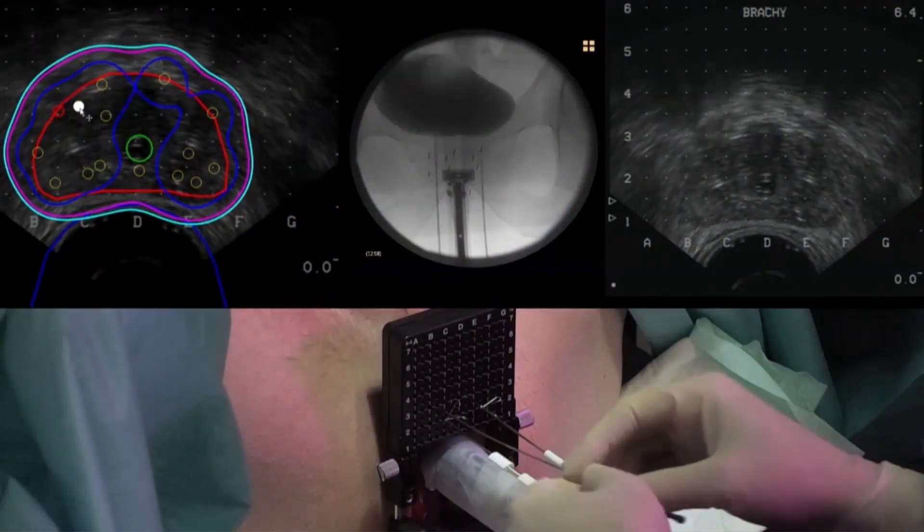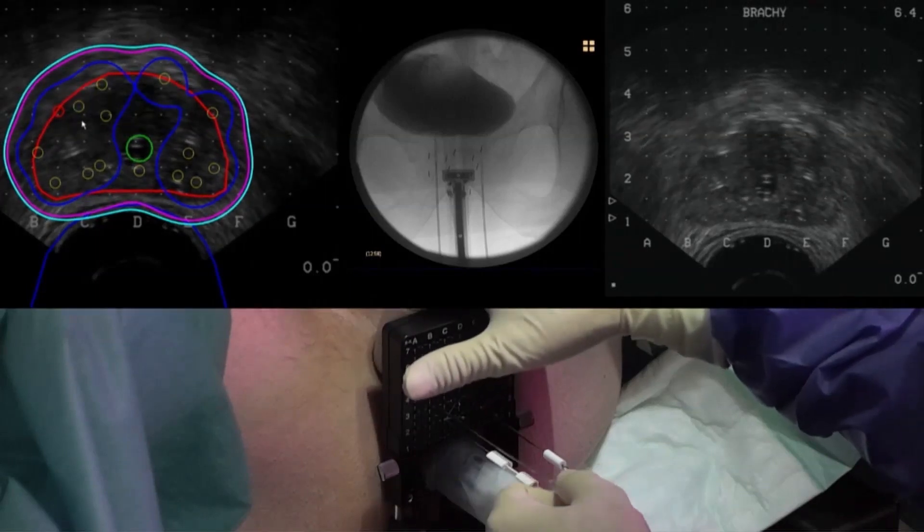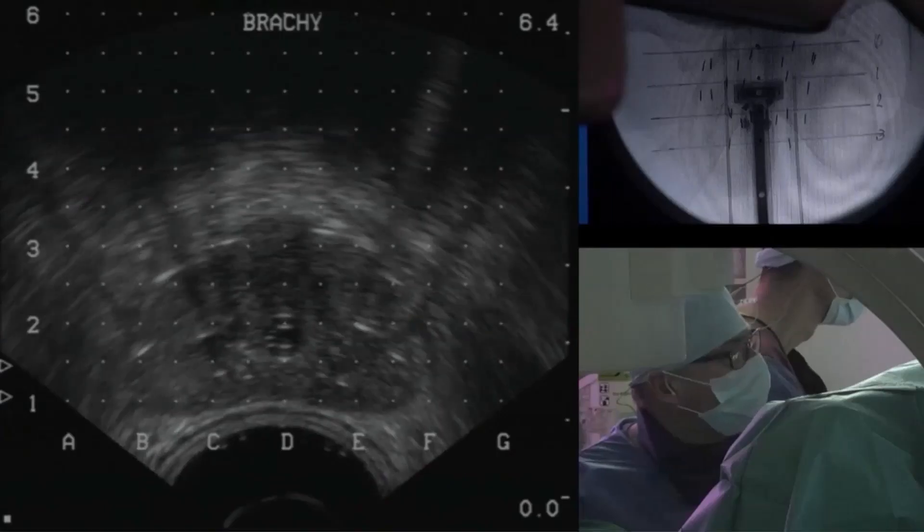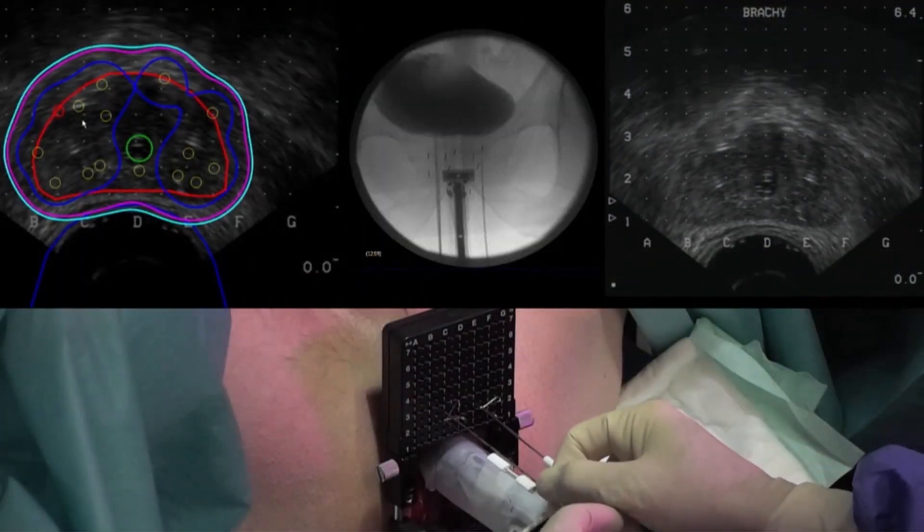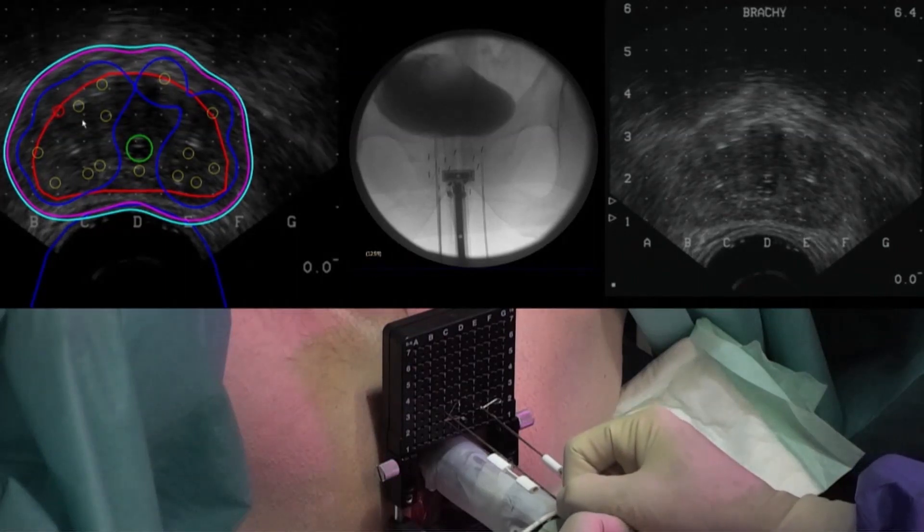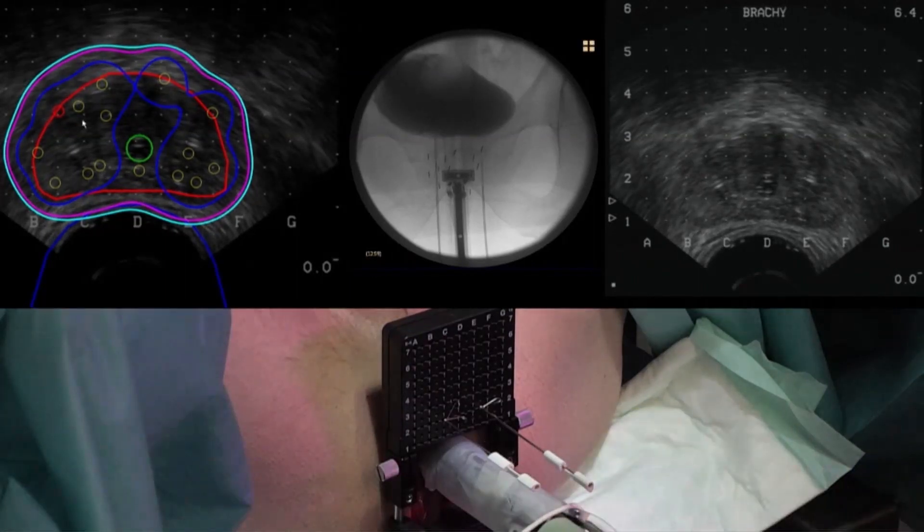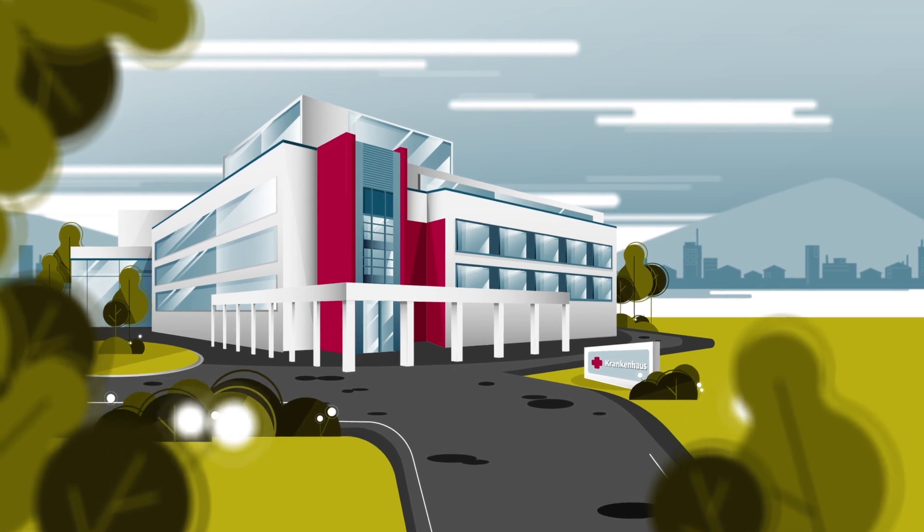The doctor guides the implantation needles into the prostate with the help of a guide called a template grid and inserts the seed chain through them. The exact positioning of the seeds is determined simultaneously with the help of ultrasound and, if necessary, fluoroscopy. The recommended prescription dose of 145 gray is administered precisely internally with a safety margin around the prostate. The risk of seed migration can be reduced to a minimum by using seed chains. The complete treatment takes about 50 to 70 minutes.